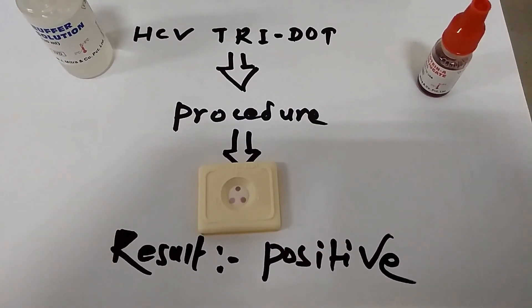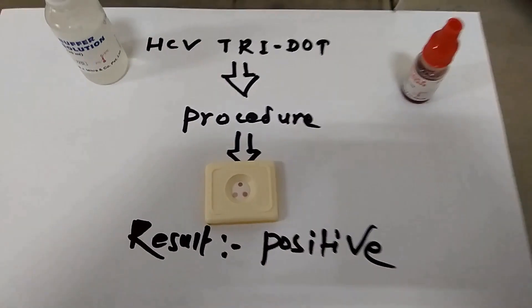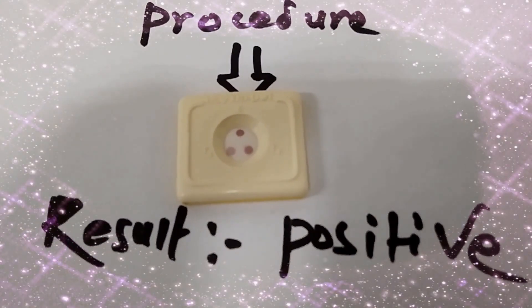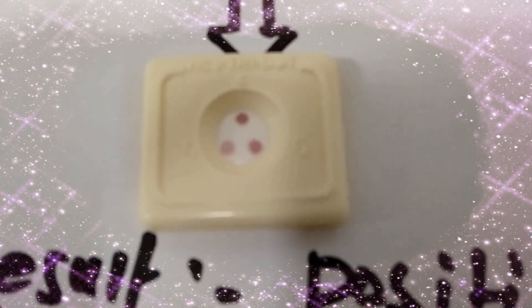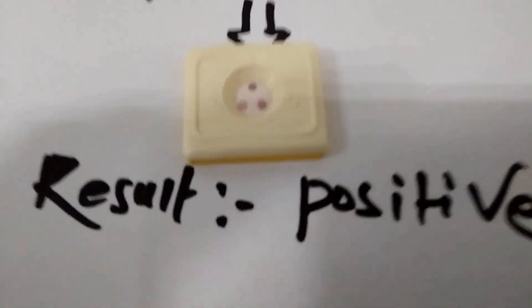On the way of ending, treat the sample and other contaminated materials with 0.5% working hypochlorite solution for half an hour.